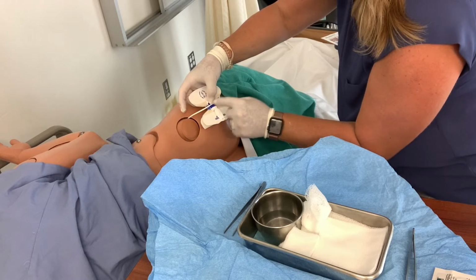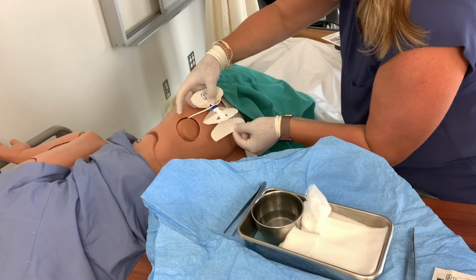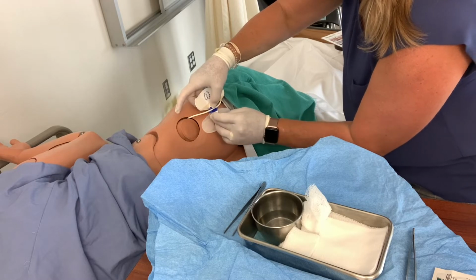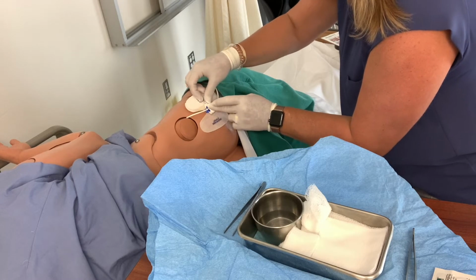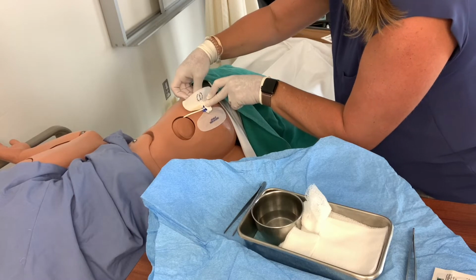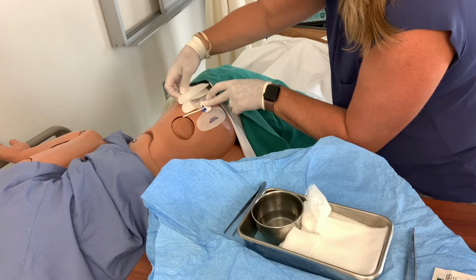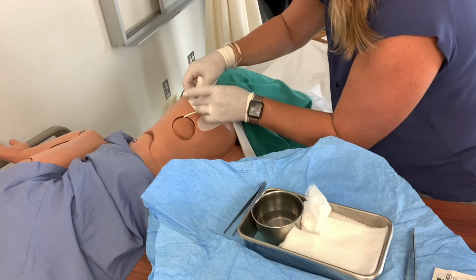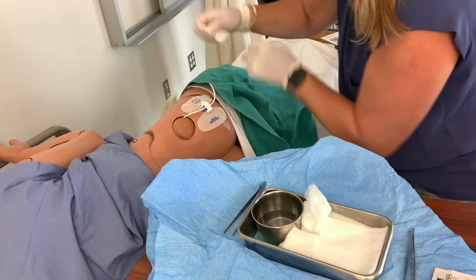Once I get it into the channel that it's supposed to sit in, I want to now put the StatLock down. So I'm just going to pull from side to side. Okay, so I'm going to put the first one down, and I'm going to close the StatLock device at this point because I know that I'm good. I'm just going to pull from side to side and have this sit, and hopefully it all comes off at once, but this is a little bit older, so there it is.